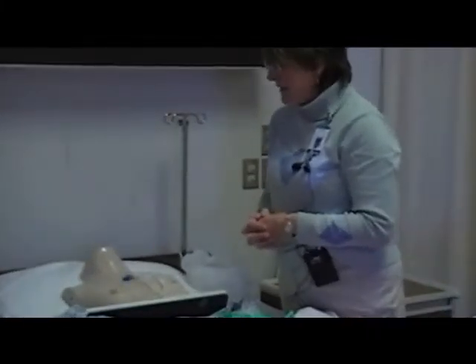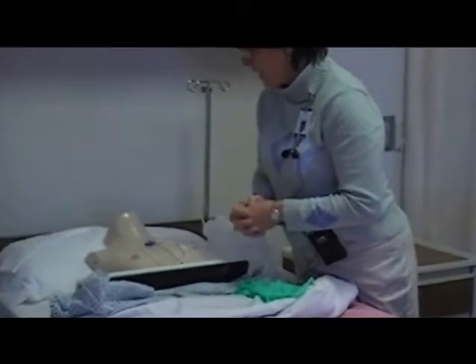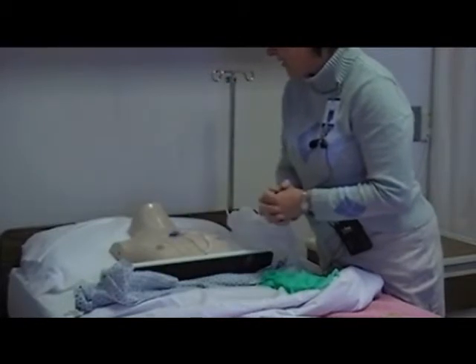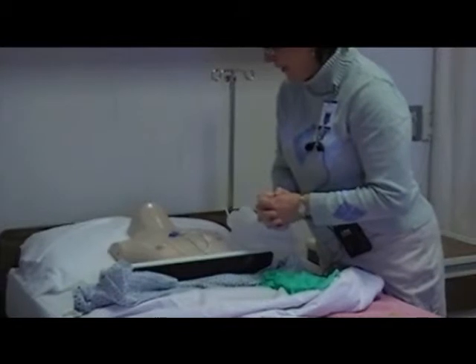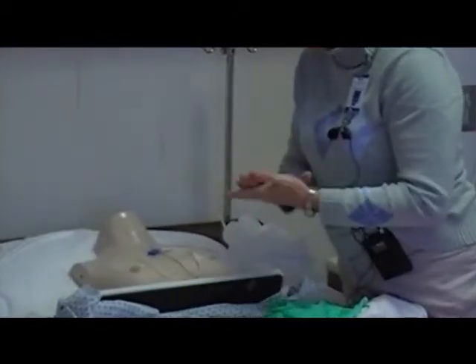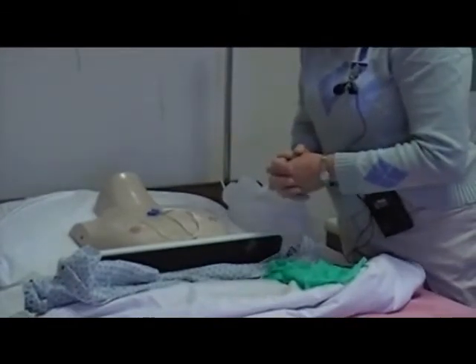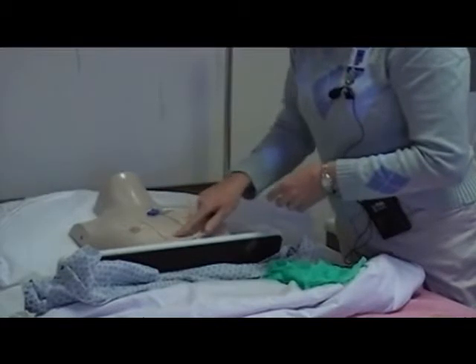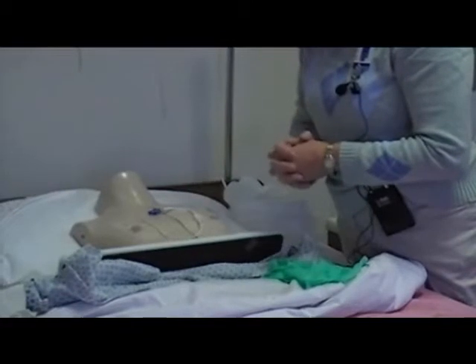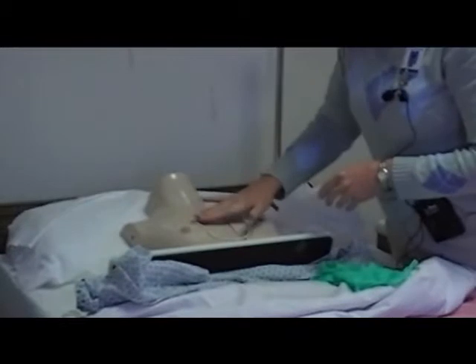Good. So at this time, I'm observing the area. I'm going to look closely to see if there's any redness, any discharge coming around the insertion site, and that's looking good. If there are sutures, I'm going to see if the sutures are still in place holding things, or if the sutures are now loose and broken away from his skin. And actually, I have put a Steri-Strip on here to simulate sutures. So he is sutured in place. Looks good.